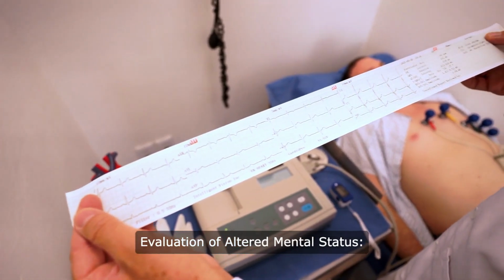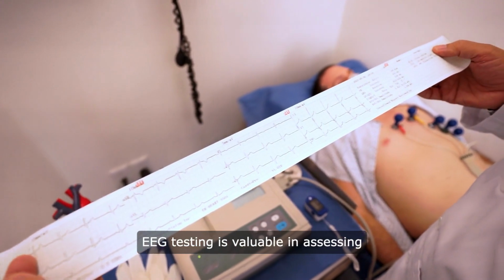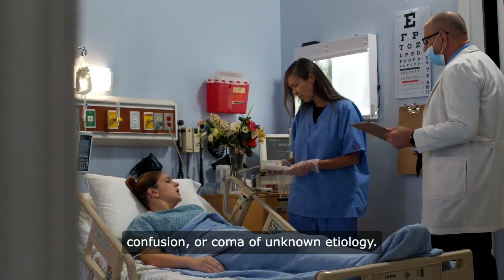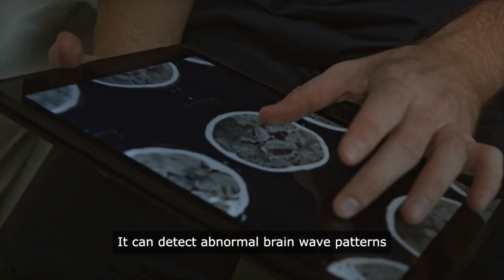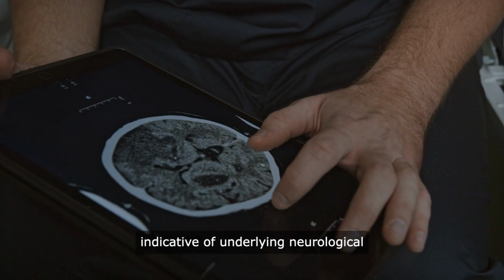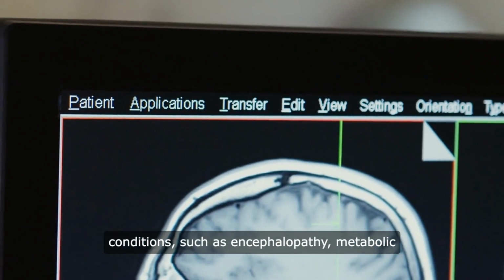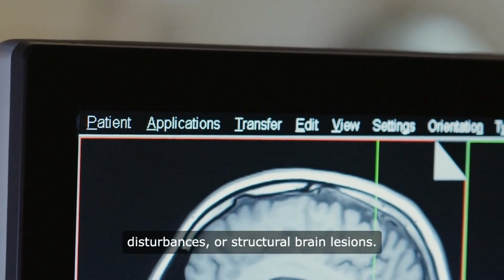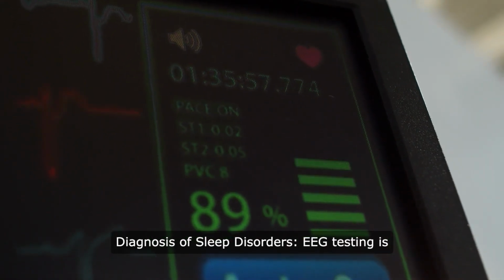Evaluation of altered mental status. EEG testing is valuable in assessing patients with altered mental status, confusion, or coma of unknown etiology. It can detect abnormal brain wave patterns indicative of underlying neurological conditions, such as encephalopathy, metabolic disturbances, or structural brain lesions. Diagnosis of sleep disorders.